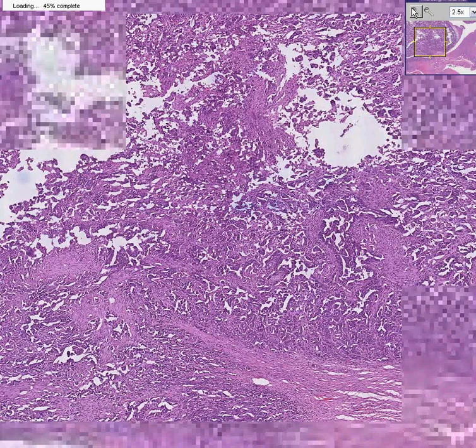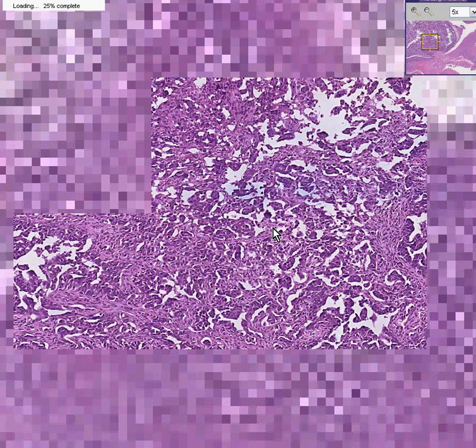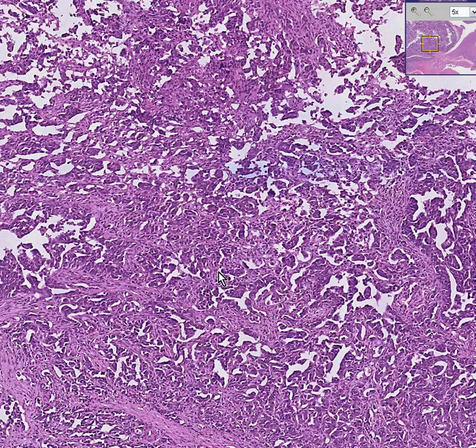This is an adenocarcinoma of the ovary. It has a classical appearance of any other adenocarcinoma. In areas, it looks like it's forming little glands. In some areas, it may almost look like it's a little bit papillary. You can see that these nests of cells are invasive into fibrous tissue.